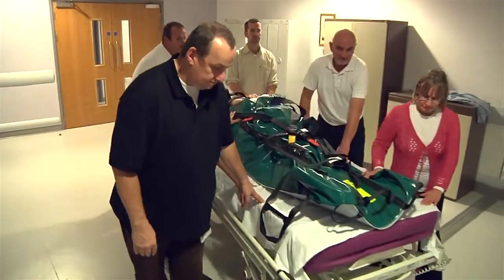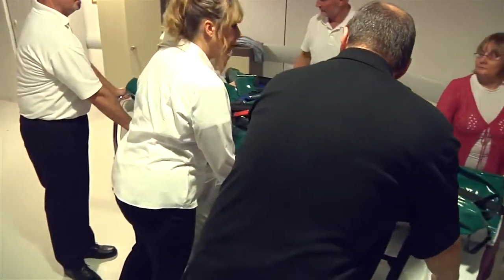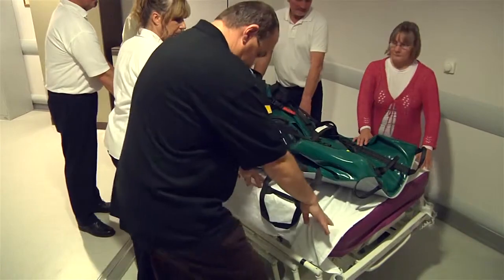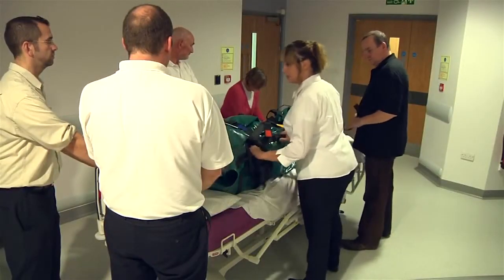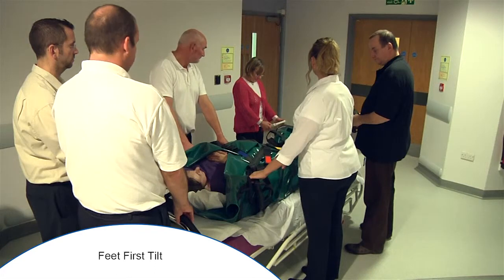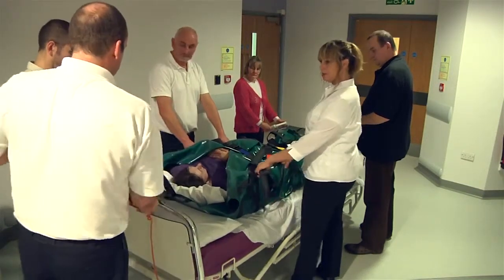Your individual personal evacuation plan must be adhered to in the safe movement of patients down the stairs. For further guidance, contact your organisation's moving and handling department. It is important that all operators carrying out the evacuation closely follow the instructions of the lead person so that everybody pulls and moves at the same time.